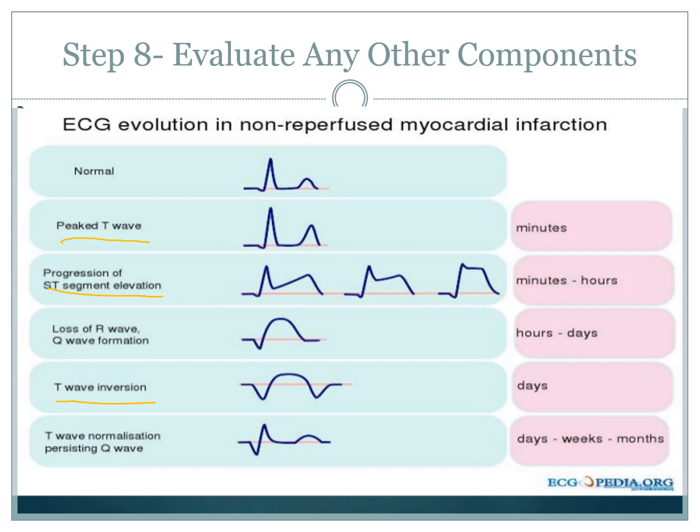Now, if you don't know what's happening, that's fine. Report your findings of the ECG, and also import your findings of the patient. Do these changes in the ECG represent physiological changes in the patient? Are they perfused? Do they have sufficient output? Do they have pain? Do they feel nauseated? All this sort of stuff. Don't just give a handover for an ECG, give a handover for a patient as well.